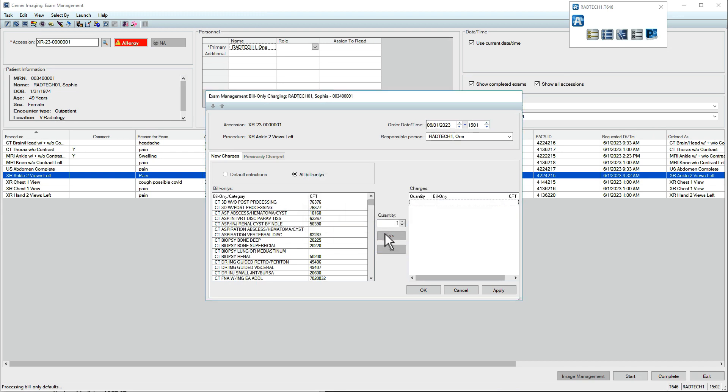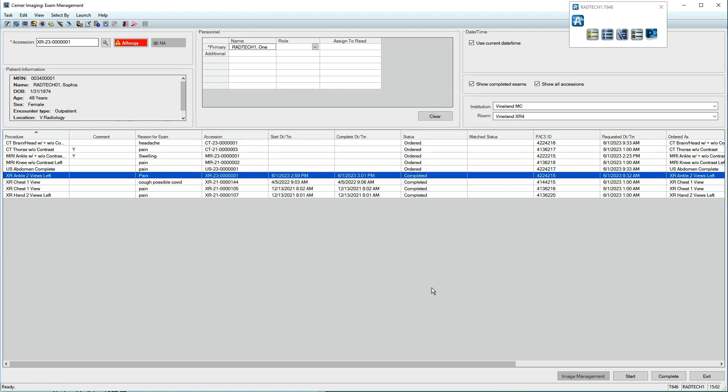Technical comments, bill-only charges, and other items related to exam documentation can be accessed from other applications as well, like the online worklist.